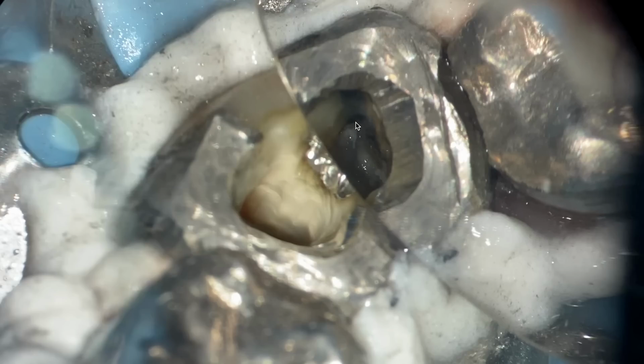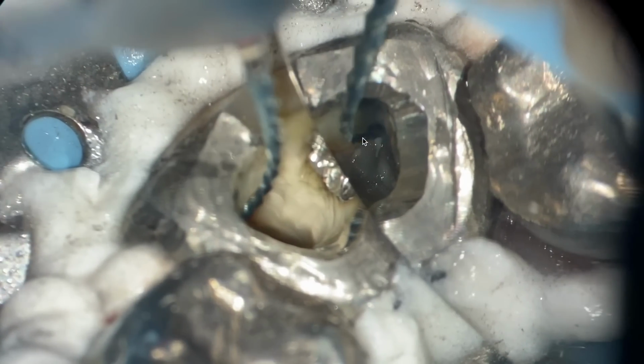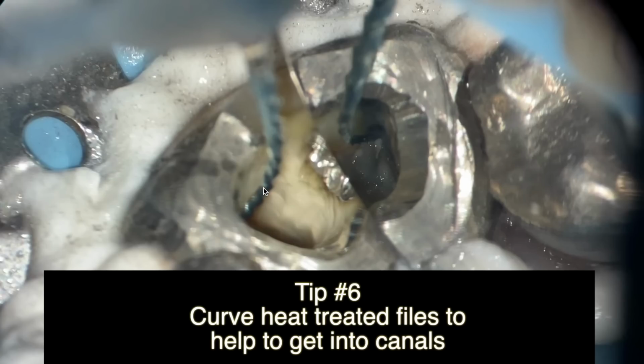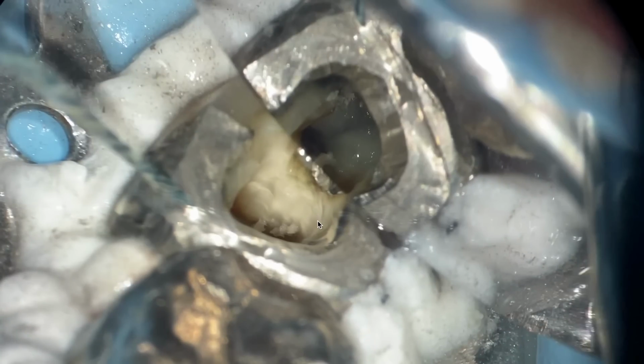Could we open up more, make more of a straight line access? I can tell you that certainly that would help. The next tip I can tell you is that bending my file like that, I've had some questions before, does that weaken the file? I haven't seemed to have that experience, but these are brand new files. And as well, I'm not taking them down to length yet. I will be. So they've only really been worked, I'd say, half a canal each. So in just the coronal portion.